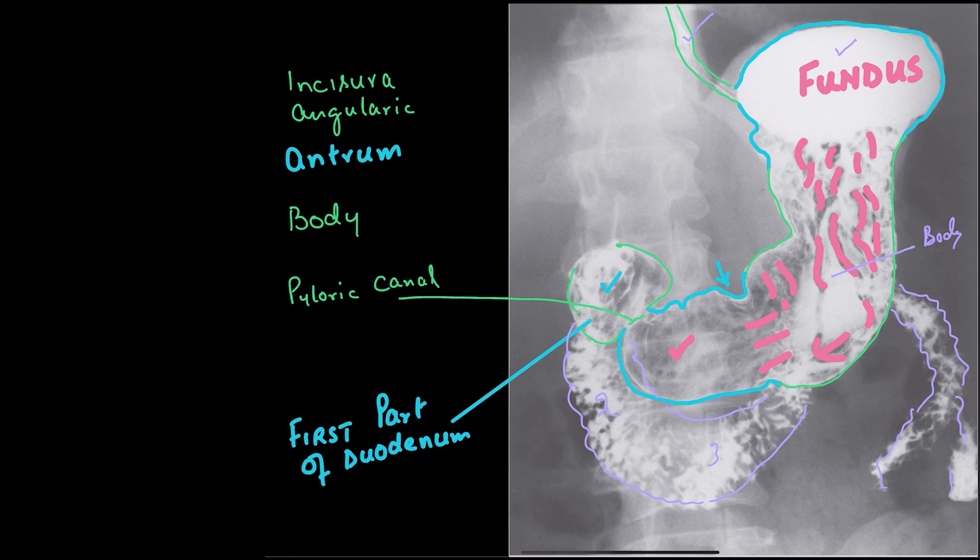The fourth part is behind this body. Because of this abundance of the contrast material, you cannot see that. Then you can see the duodenum becomes the jejunum. The landmark where we can demarcate that duodenum is becoming jejunum, that flexure is being highlighted by a ligament and that is known as the ligament of Treitz.